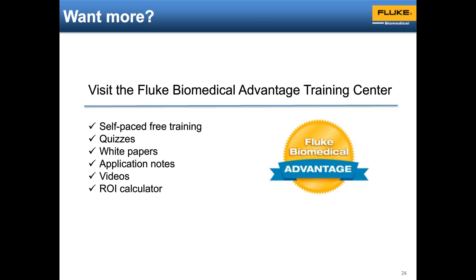Great. And can you comment on electrical versus optical simulators for SpO2? Sure. So an electrical tester basically tests the continuity of the cable and tests that the cable is in good shape. An optical simulator, which is what most of us have, tests the actual sensor along the R curve. We have an older product called the Index that still tests electrically, and that's the basic difference, whether you're just testing the optical sensor or you're testing the continuity of the cable as well.